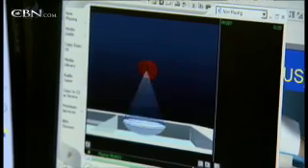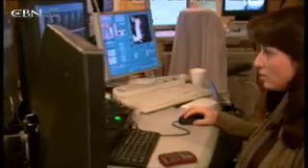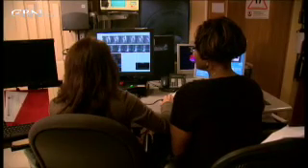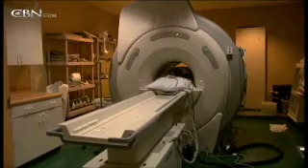They're focused to a point, and only at that point where they're focused will they have an impact. It's just like someone would take a magnifying glass and use the magnifying glass to focus the light of the sun. Now with 160 of those surgeries performed, LeBlang says the procedure is like the ultimate video game, thousands of clicks per surgery. But the results are very real for LeBlang's current patient, Robin.